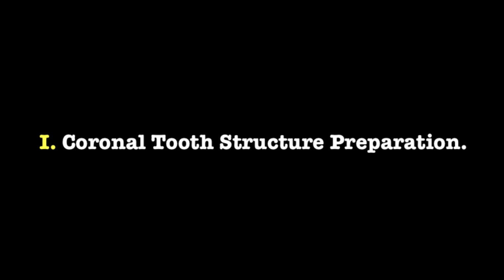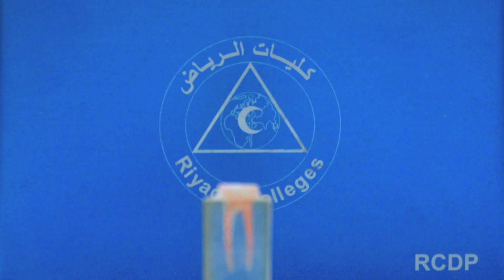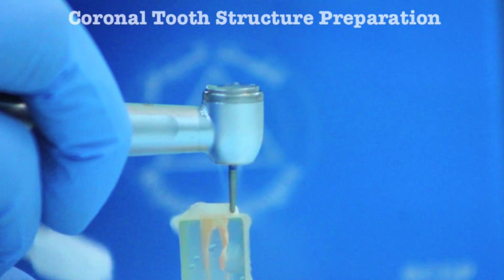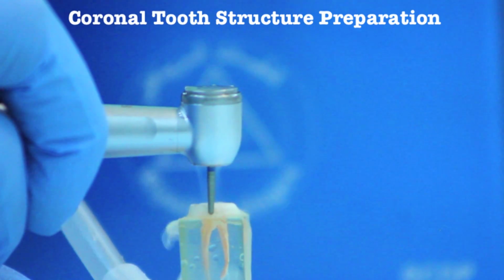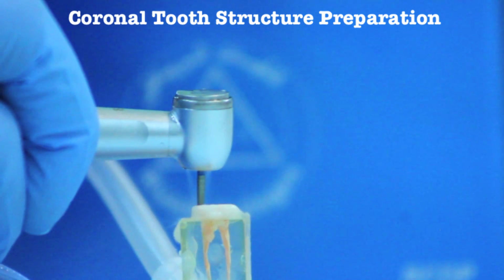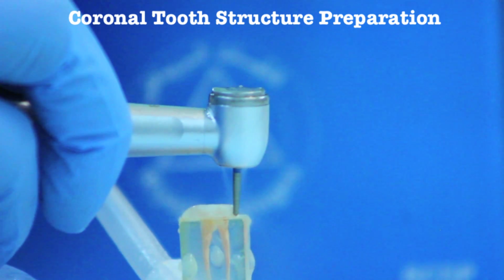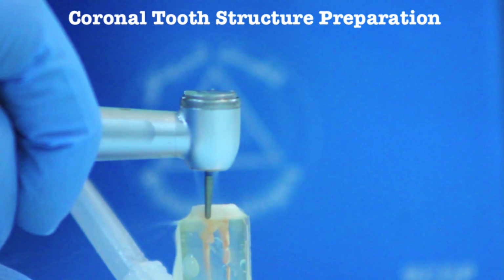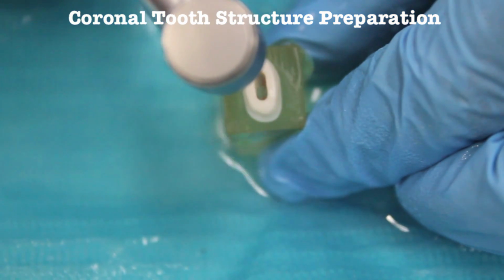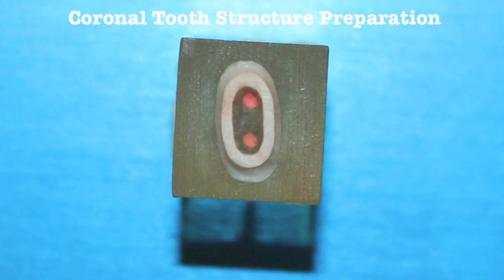First, coronal tooth structure preparation. Using a round and tapered diamond, prepare the remaining tooth structure as if the crown is intact, ignoring the missing coronal tissue, meeting the same principles of tooth preparation. Remove all internal and external undercuts that will prevent withdrawal of the pattern. Any unsupported tooth structure is removed as well.